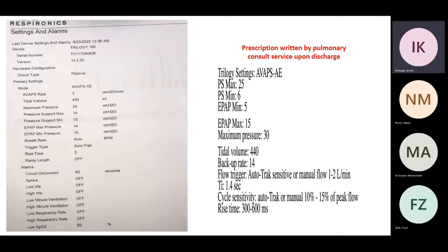The pressure support maximum, it's a mistaken typing, we wanted 35. I said for this patient, I don't have any emphysema or anything, so I think that's fine even if it reached 35, because she needs a lot.